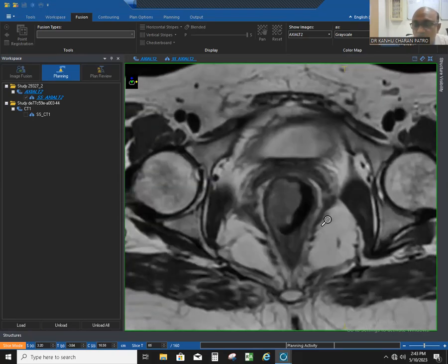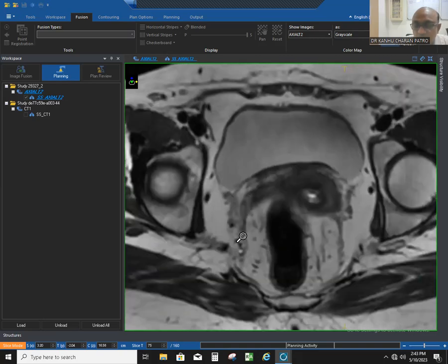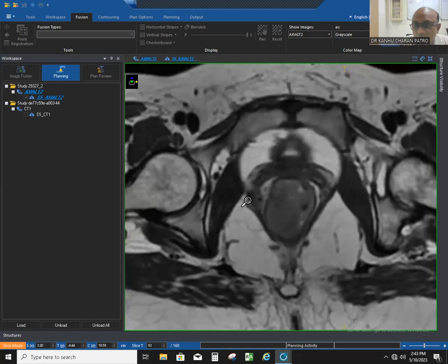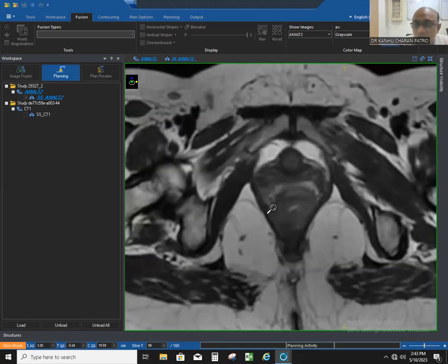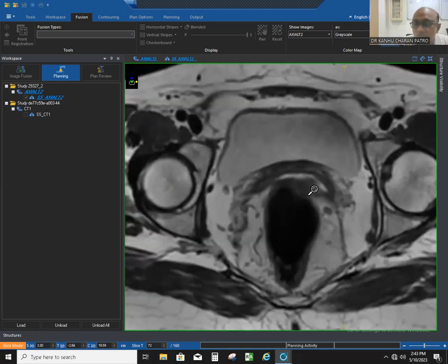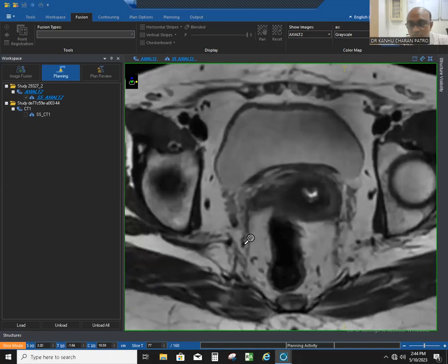You can go up and see the mesorectal fat. When the levator ani muscle merges with the rectal wall, the mesorectum finishes. You have to contour this fatty tissue around the mesorectum. Remember this black area is the mesorectal fascia, and there are mesorectal fascia, lymph nodes, and other structures — and this is the mesorectum.